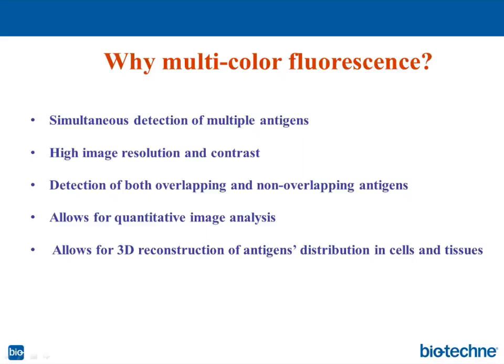And what's also more important is that using fluorescence, we can do 3D reconstruction of the tissue section or antigen distribution in the thick tissue. And that's quite often done by using, for example, whole mount incubations, or another way of calling this technique is free floating sections, when unlike 5 or 10 micron thick sections, we can use very thick 50 to 250 micron thick sections, and then do Z-stack using confocal microscope, and then reconstruct them and get a 3D object.